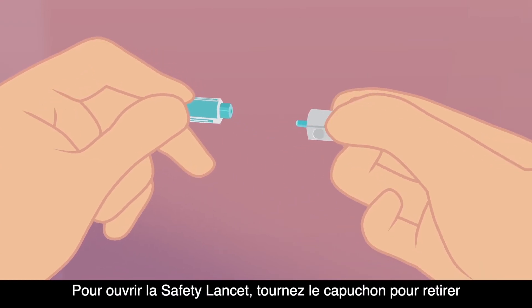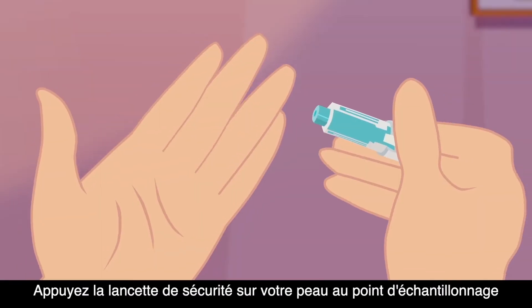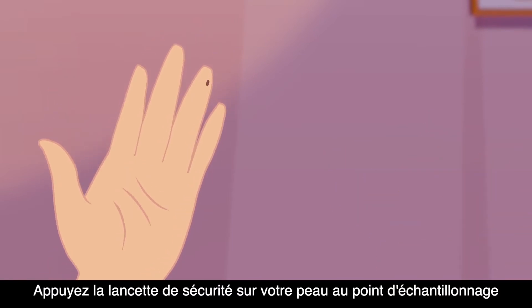To open the safety lancet, twist the cap to remove. Press the safety lancet on your skin at the sample point.